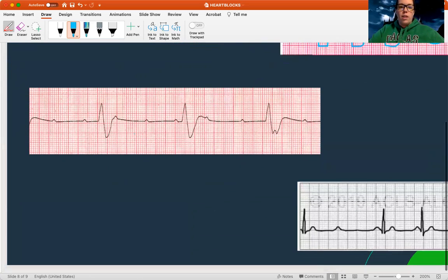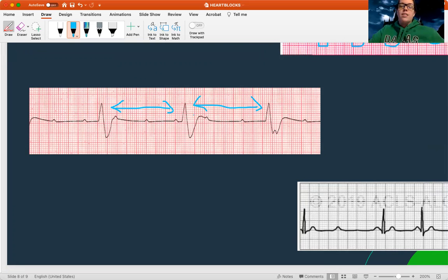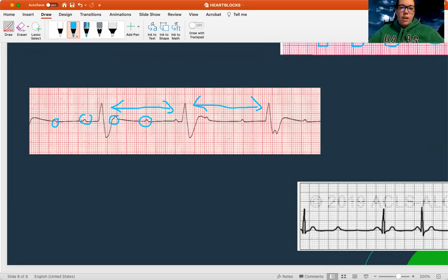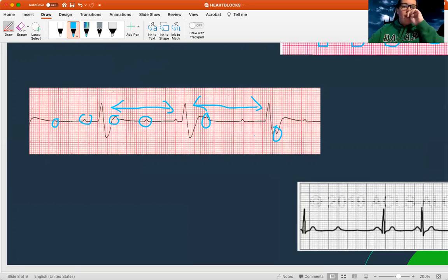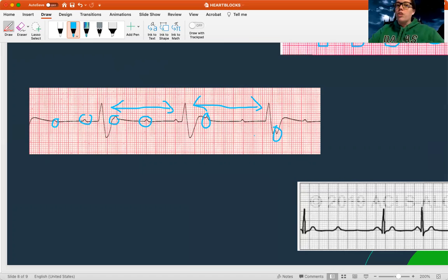Now let's look at this one. It seems to have a normal R-to-R — the same distance between these, and I notice it's kind of slow. This is either a first or third degree. Now I need to look at my P waves — are there a bunch of P waves everywhere? Yes, there are! There's a P wave here, one here, one over here in this T wave, one poking up in this T wave again, and it looks like there's even a P wave down in here. The top and bottom of the heart aren't talking — the top keeps sending beats at 60 to 100, the bottom does its own rate of 20 to 40, and they trample all over each other. This is a third degree block.